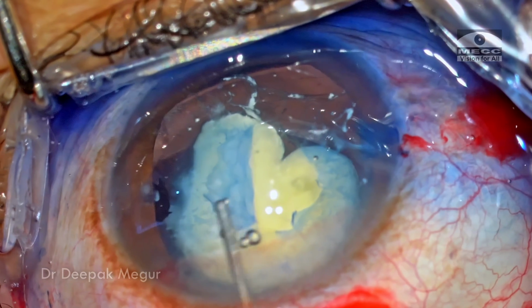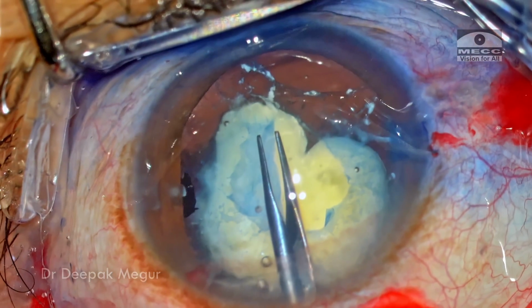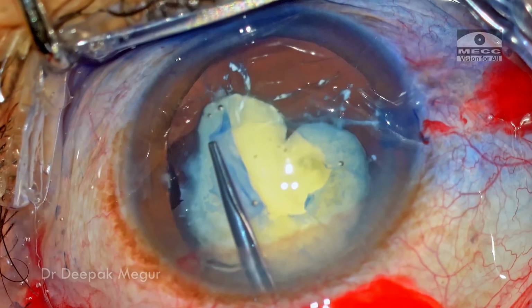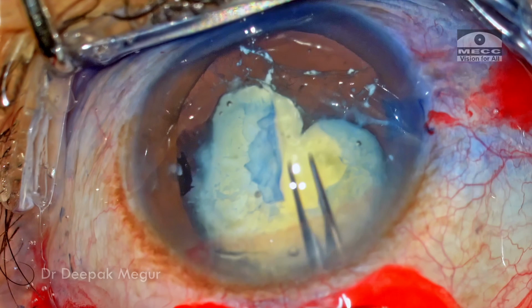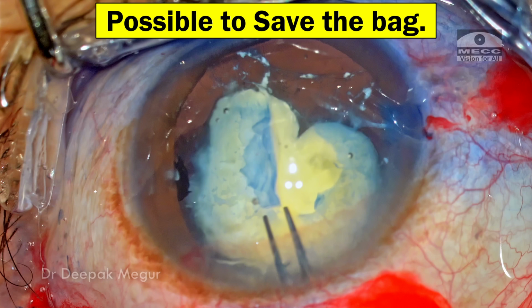I refill the bag with OVD and then try to switch from a needle to a forceps, but the results are the same. I'm unable to proceed and I'm worried that if I proceed, the entire bag is going to come out. At this stage, my subconscious mind is thinking whether it's really possible to save this bag.